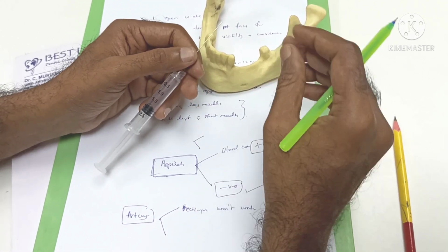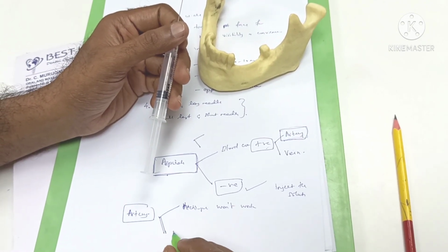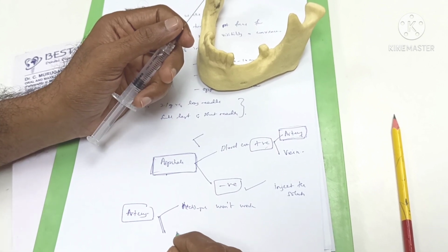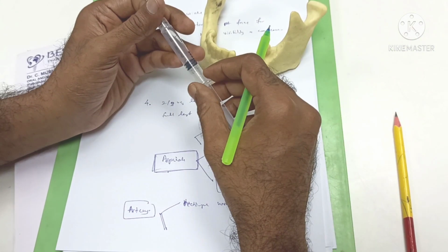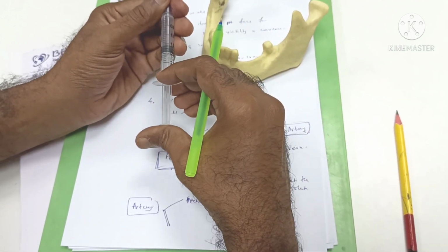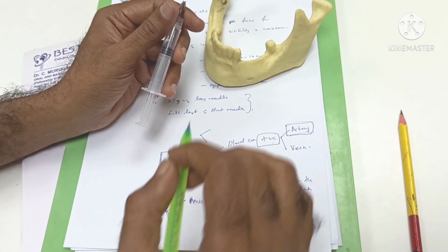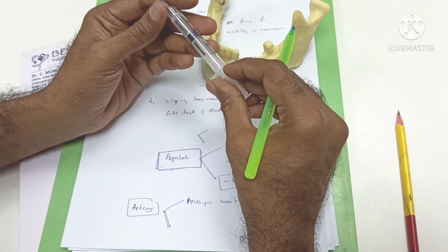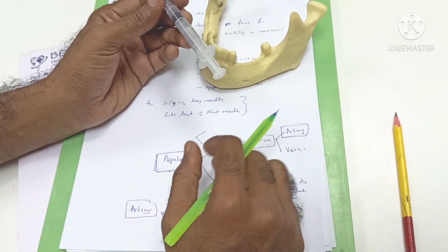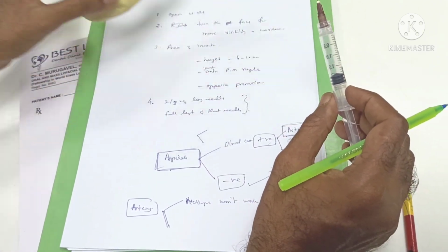The patient will tell he doesn't have any lip or tongue numbness. And the second thing is the patient will have symptoms of systemic toxicity of lignocaine: tachycardia, sweating. These things will happen. The patient's pulse will go up. So this must be the reason: injecting the entire solution into the artery. So aspiration is very important, don't forget to do this, especially for inferior nerve block.